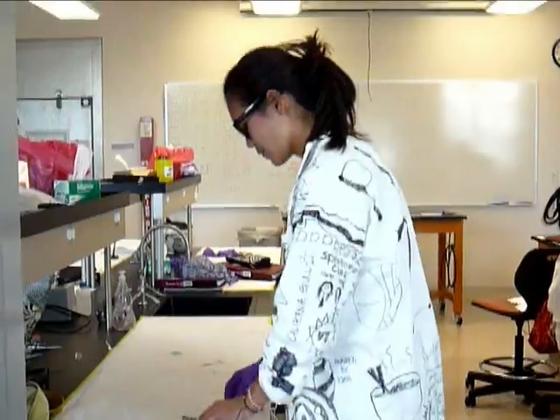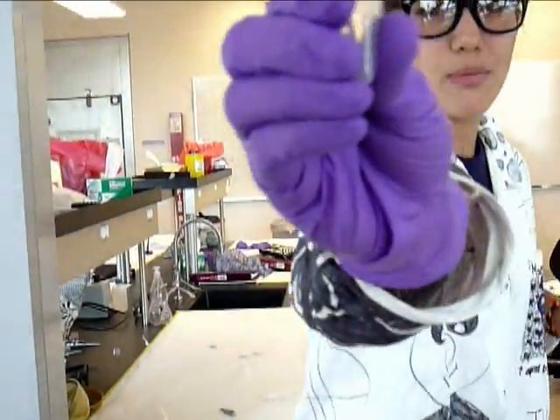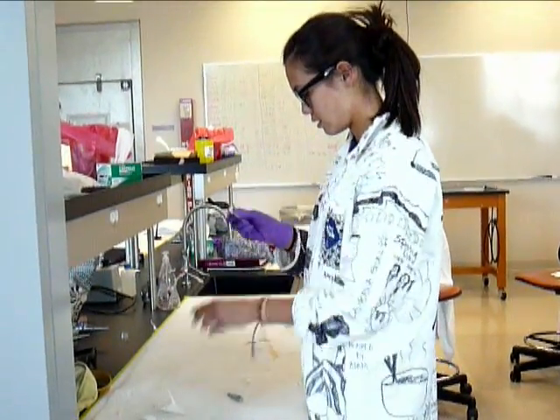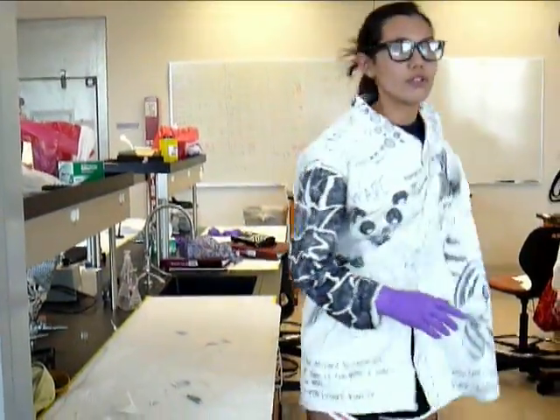And so, first what you do, you get a microfuge, you label it with your initials — NP — microfuge, and then you take your alcohol and then you swipe your finger so it's all clean and nice and doesn't get infected, and then you wipe it.